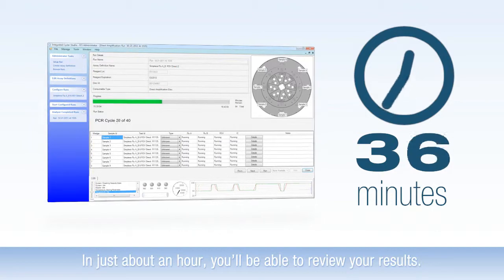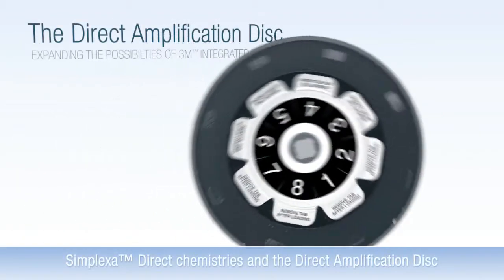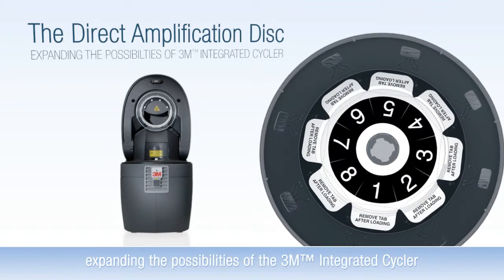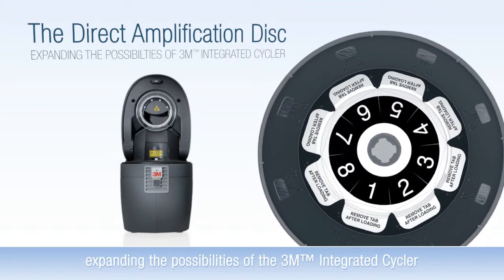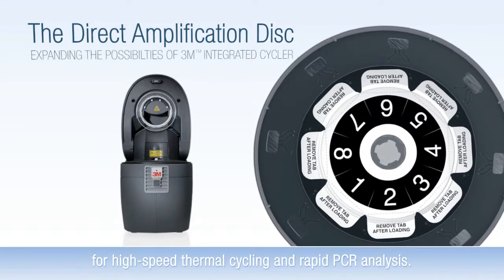In just about an hour, you'll be able to review your results. Symplexa Direct Chemistries and the Direct Amplification Disk — expanding the possibilities of the 3M Integrated Cycler for high-speed thermal cycling and rapid PCR analysis.